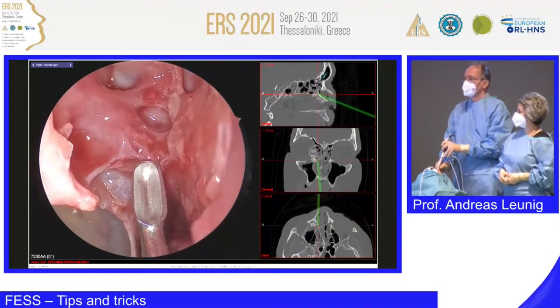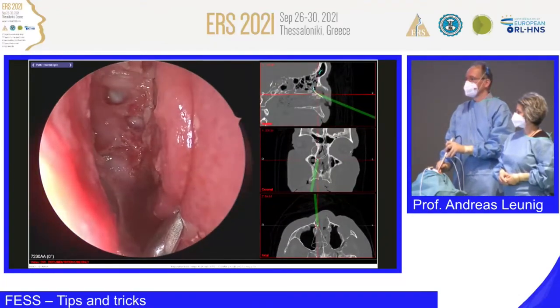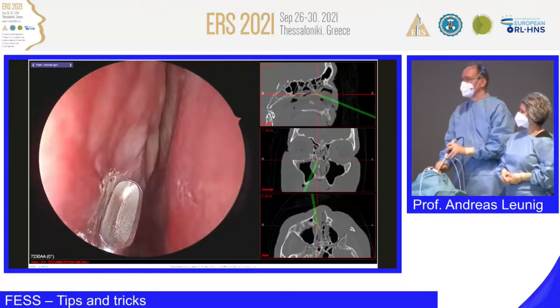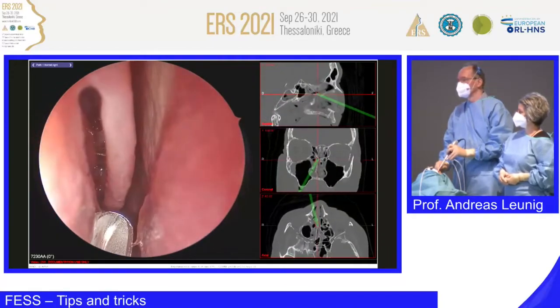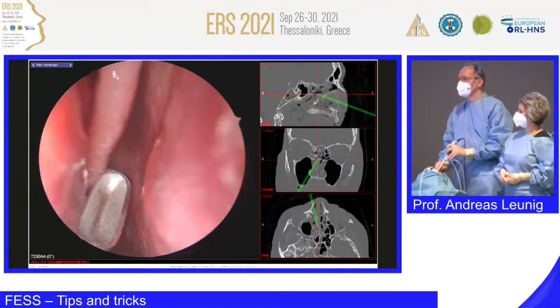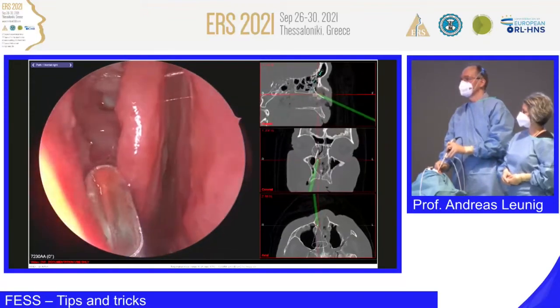So we are not yet in the posterior ethmoid. We could come back. We are going in between the anterior ethmoid and the middle turbinate. We are looking here very gently. This is the superior turbinate. Maybe there's a little bit of ice up there, or only a little bit of water. And these are the structures you will see. We don't see anything open, so we are not yet in the posterior ethmoid.